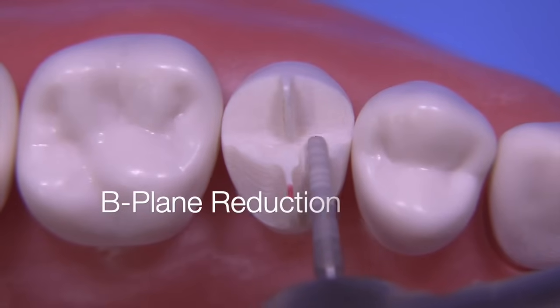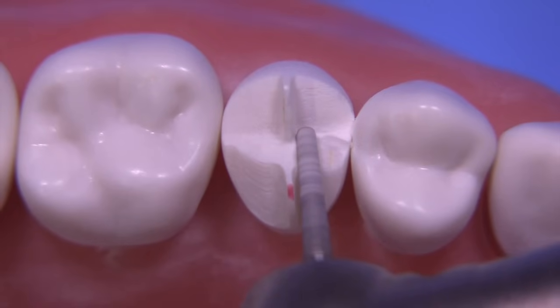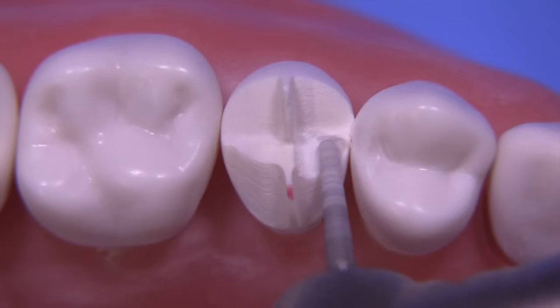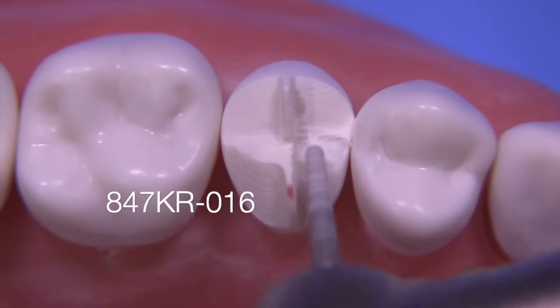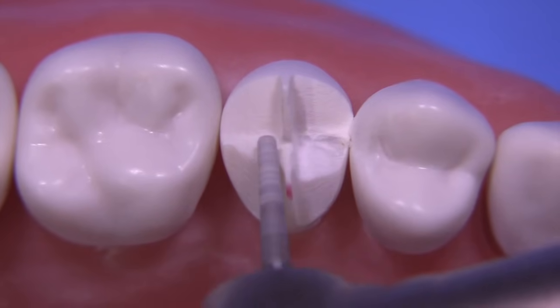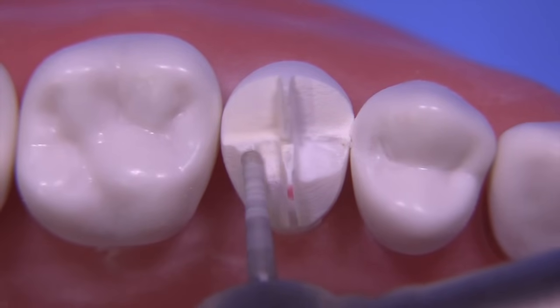I've utilized this technique clinically and it's worked out incredibly well. Sometimes it's hard to see how much you've reduced even when using a preoperative guide, but when you're using a portion of the tooth itself to provide that information, it's surprisingly easy to see how much you've taken away. Here we're placing the B-plane.